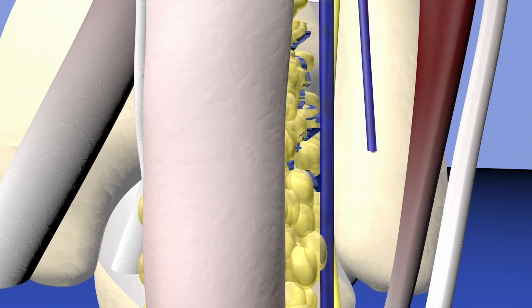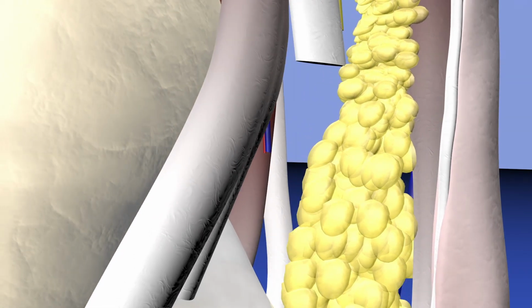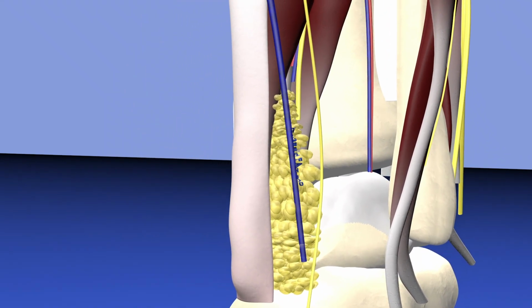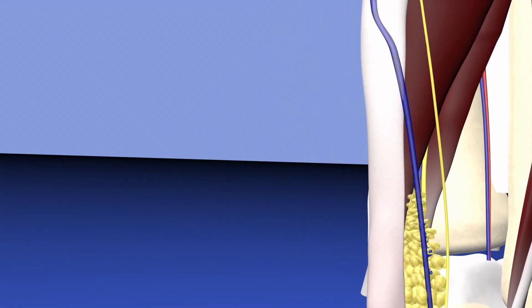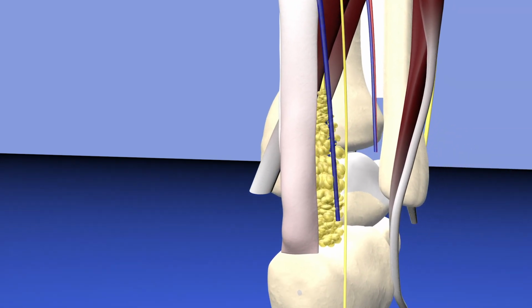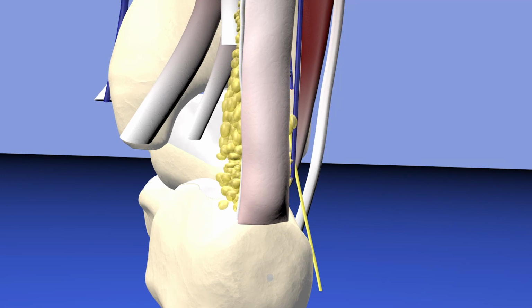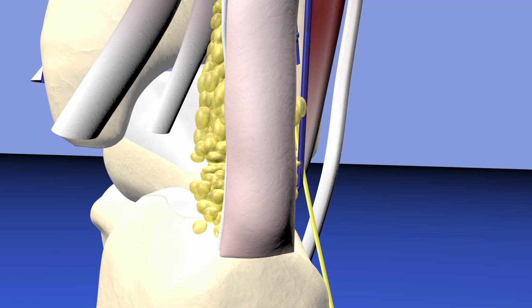And now we're zooming in. And again, you can see the Kager's fat pad and the tibialis posterior, flexor hallucis longus, and flexor digitorum longus tendons medially. The tendons, however, are cut off and not complete in this case. And here we are, we're zooming out, and we can get a sense of the distal Achilles tendon as it's somewhat bulbous in shape, again consistent with tendinosis. She also has an intrasubstance tear in the distal Achilles tendon, which you cannot appreciate here.